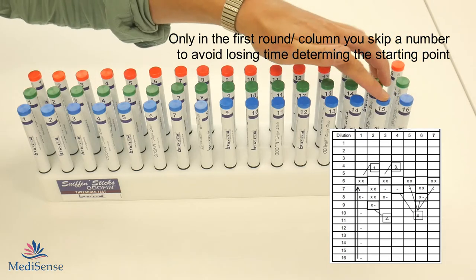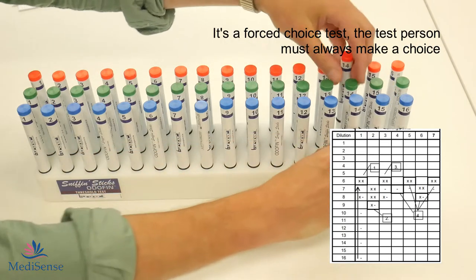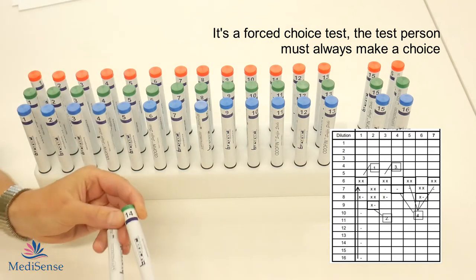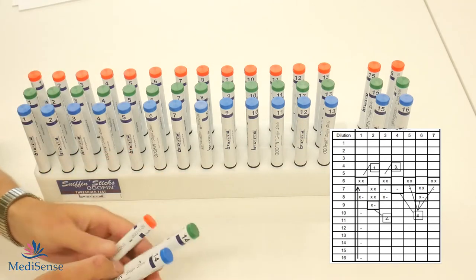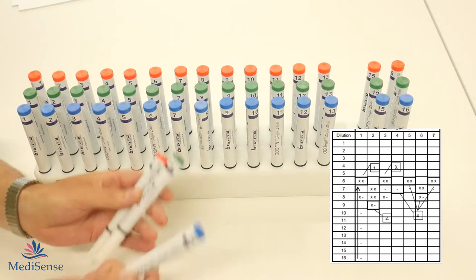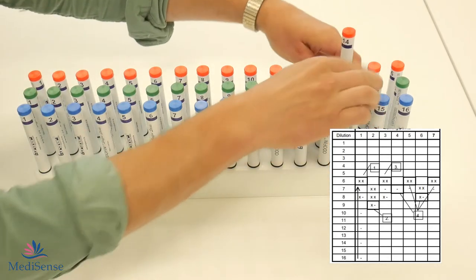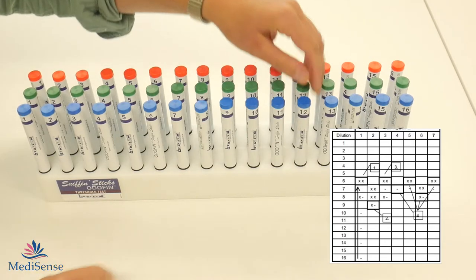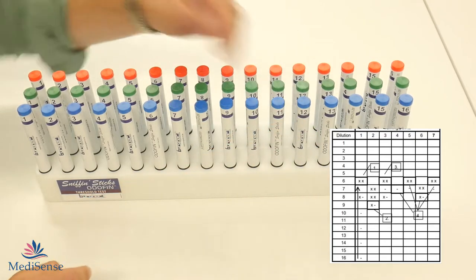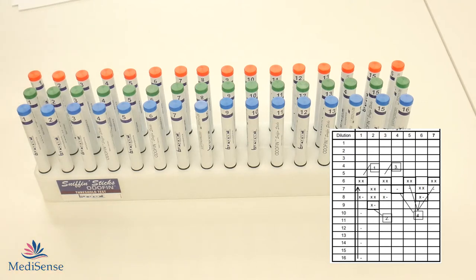So you start with 16, skip the 15 and go further with 14. Now you repeat the cycle and offer the pens with number 14. If this is not guessed right then you continue with the pens with number 12 and so on until the test person guesses the pens right.